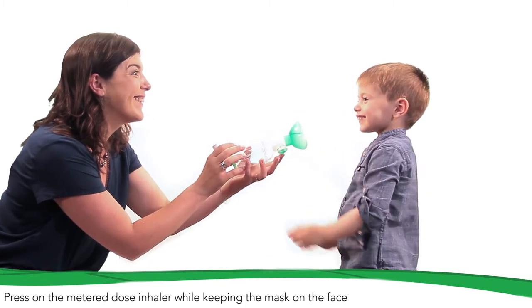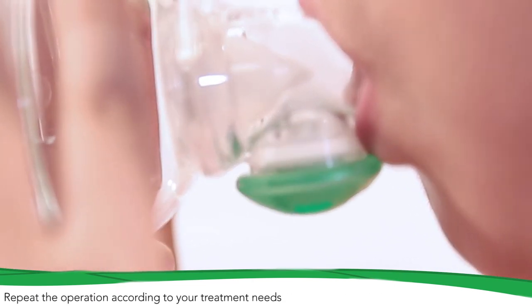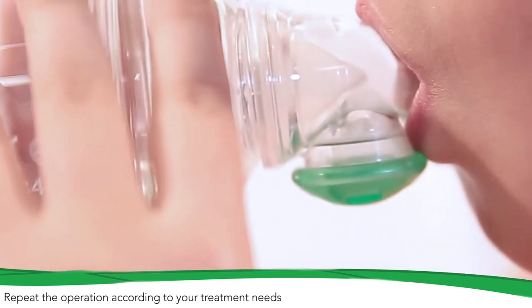Check the correct inhalation of the drug through the expiratory valve movement. If necessary, repeat the process according to your doctor's prescriptions.